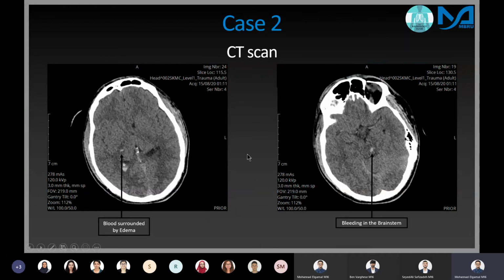All right. So after this CT scan, the doctors were more or less not so worried because you wouldn't treat this surgically. Let's just take it from a surgeon's point of view. You wouldn't treat this surgically. You would treat it conservatively. You would put the patient in the ICU and just monitor him and make sure he's breathing and he's getting better. And obviously treat other injuries, right?